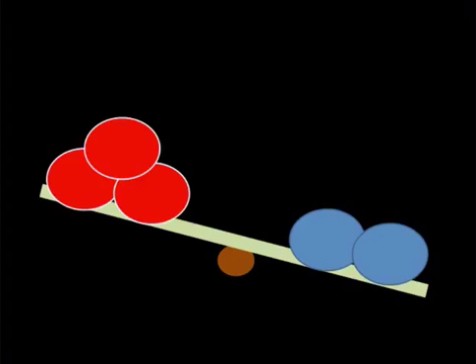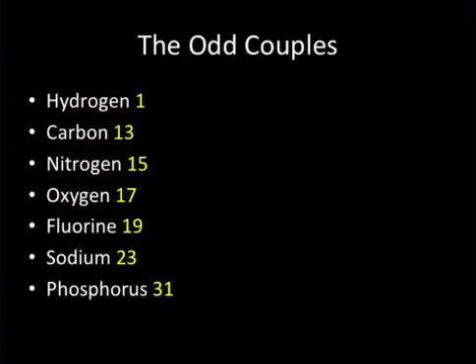If you've got an odd number, no matter what your combination is, there's going to be some net spin in one direction, which makes it active. Now, here are the examples of some of the more common elements that can exist that will obey this rule, and the majority of these exist at some concentration in your body. This one, obviously, is the one that's most commonly used.